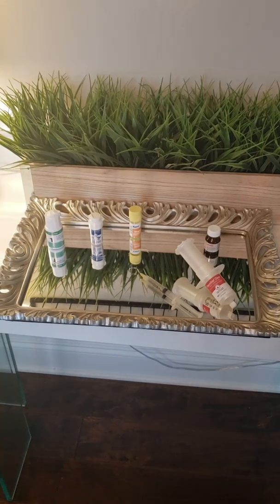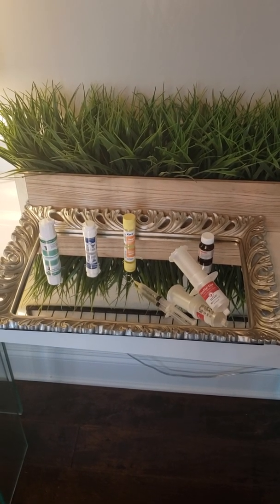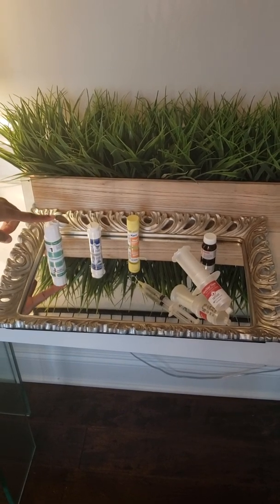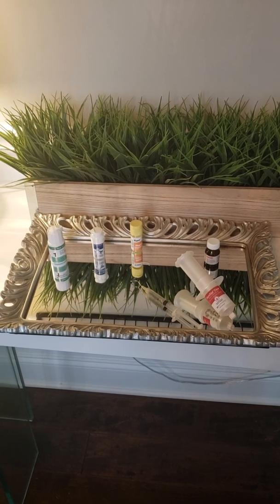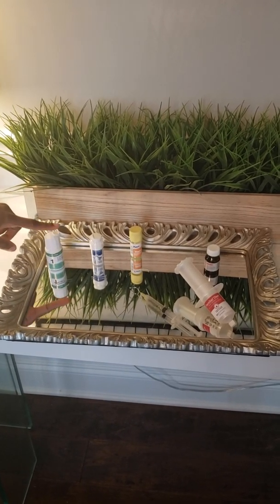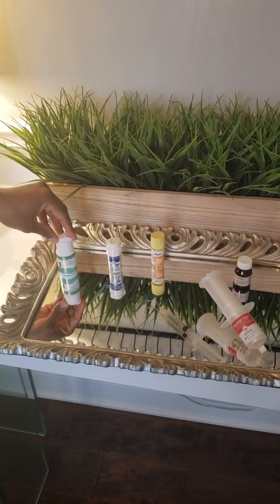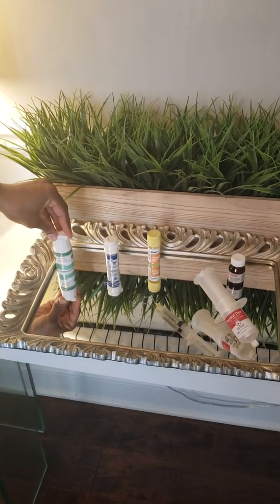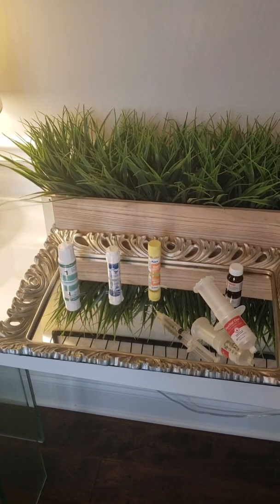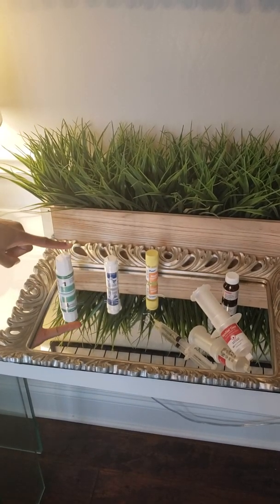that already stops the bleeding. So some doctors may or may not choose to dip it in the Hemodent because it already has the agent in it to stop bleeding. For me, I always want to be safe than sorry, so I always dip it in the Hemodent regardless. So this is a Gingipak. Again, it's green. It's a really good cord. Most doctor offices do use it. And again, it is a braided cord, and it already has an agent in there to stop the bleeding. And this comes in different sizes from 00 to 0 to 1 to 2.